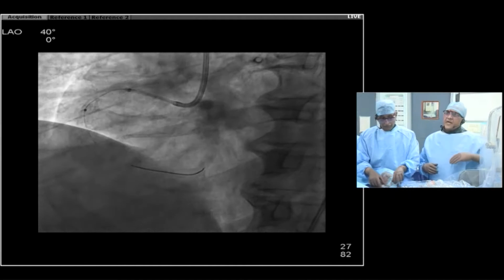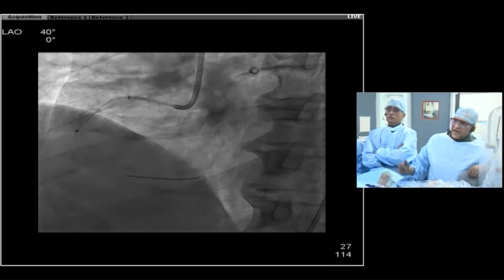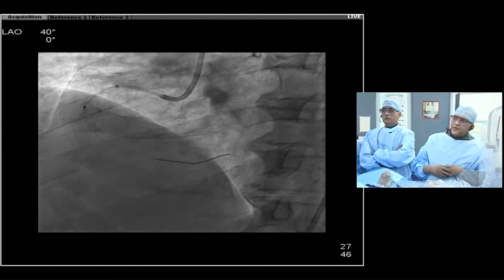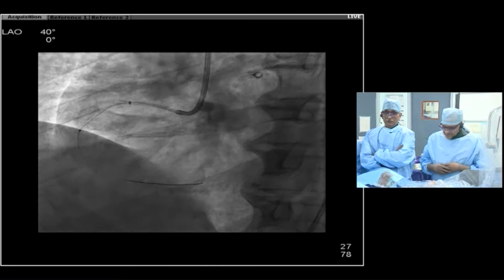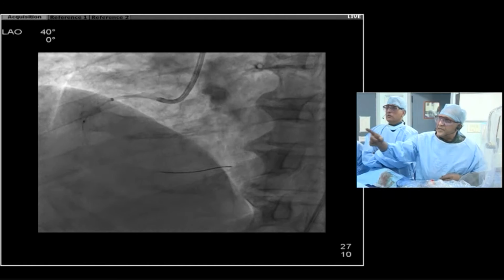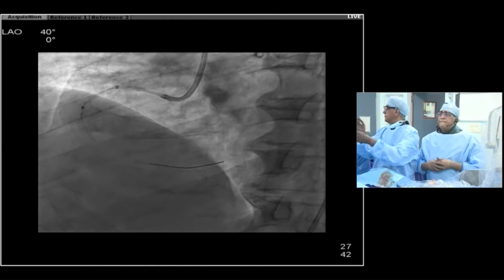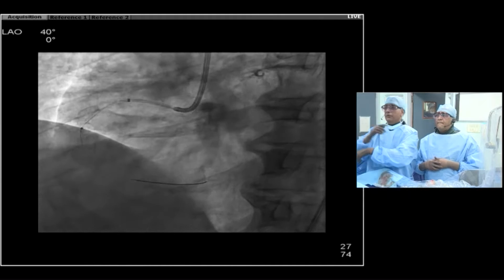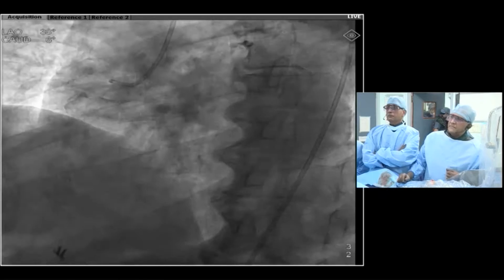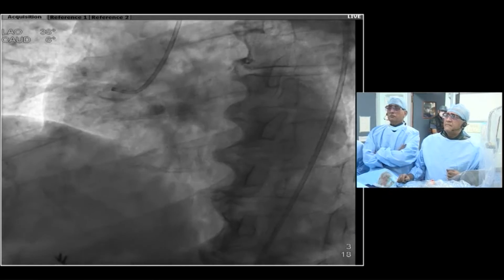And I think it's amazing because what we've seen is that after the laser, most of the time, our IVUS catheter will just fly through. Yeah, we have. Show me the angio sometimes before we see that. But oftentimes, especially for proximal caps, we still have to do further modification work and sometimes even atherectomy, a little balloon, in CTOs, but it just depends on the type of case.